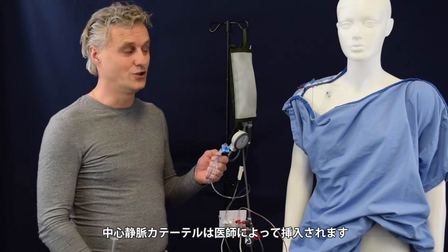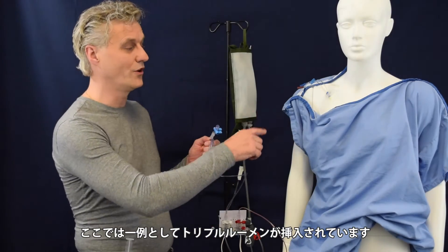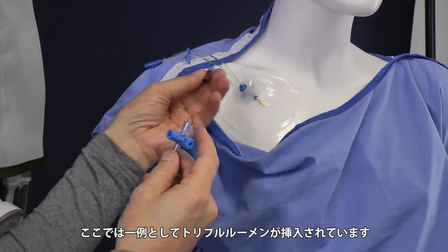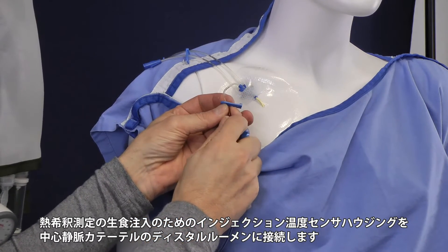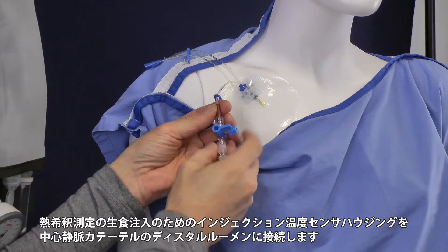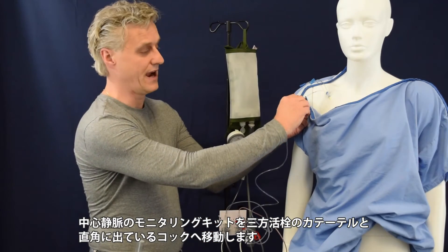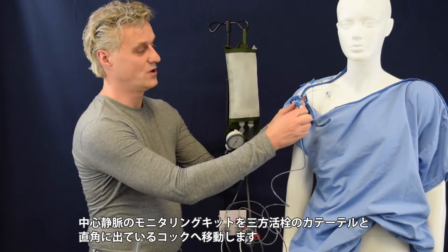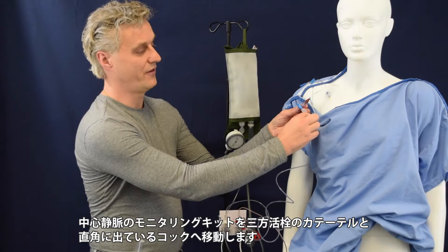We are going to connect it to a central venous pressure catheter being placed by a doctor. In this example we are going to use a three lumen catheter. After flushing the system we are going to connect this one to the distal lumen of the catheter. So we are going to remove the blue cap here, take out this one and place it on the right part here.